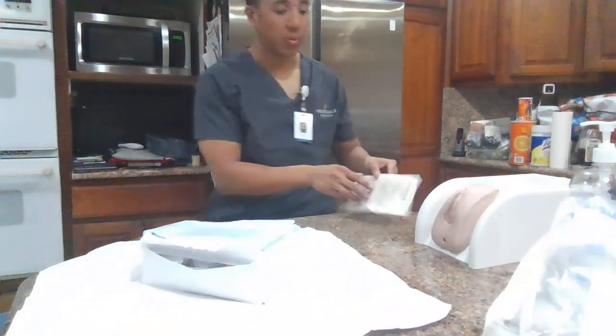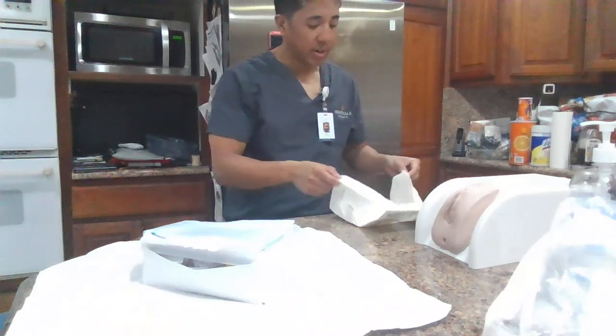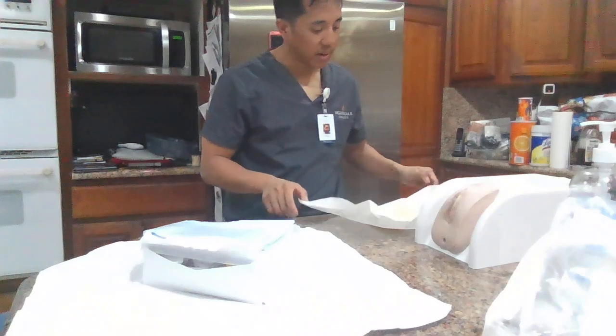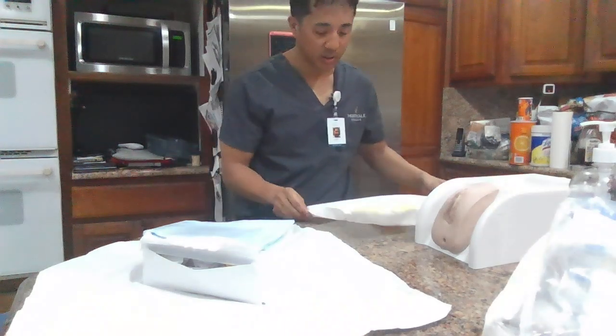I am now going to perform open gloving. And as I am putting on my gloves, I'm going to ensure that I don't have any rings or watches.